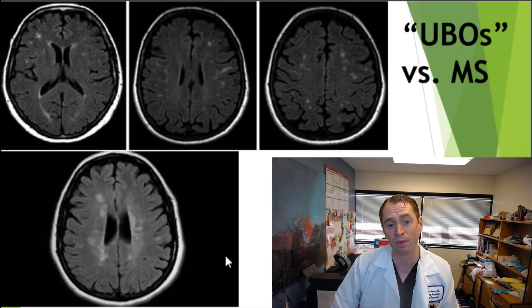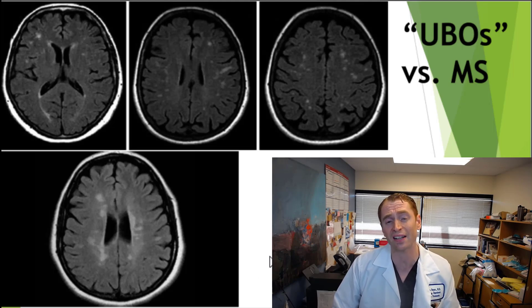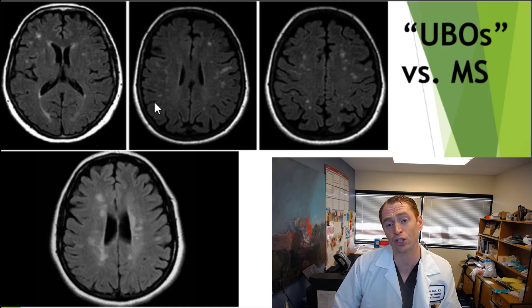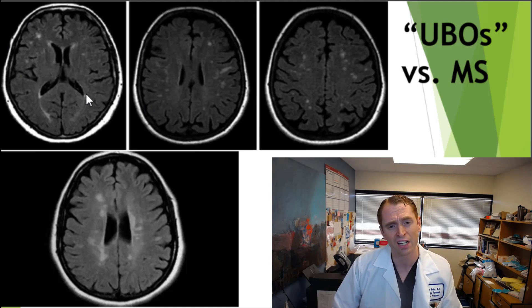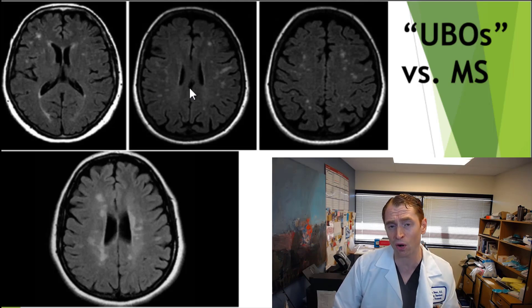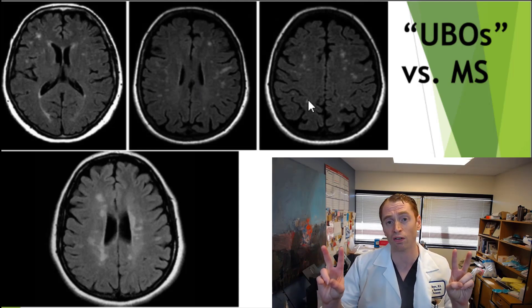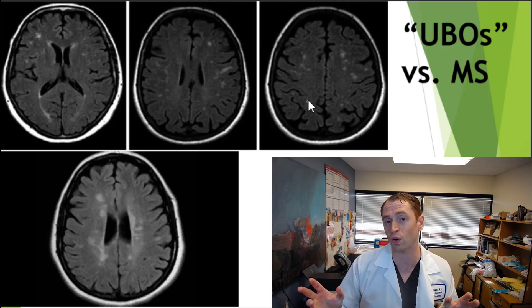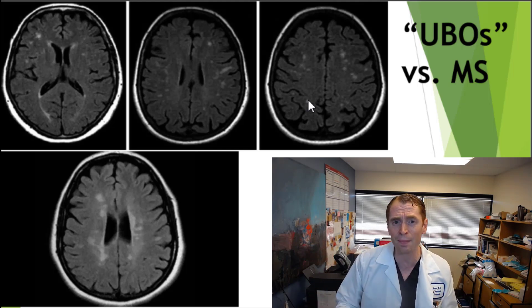For instance, the MRI on the bottom shows subcortical and periventricular white matter lesions, highly typical of MS. But the MRI on top — three slices from the same scan — shows patchy, subcortical, poorly defined white matter lesions not in typical locations associated with MS. These are so-called UBOs, or unidentified bright objects, and they're very common.